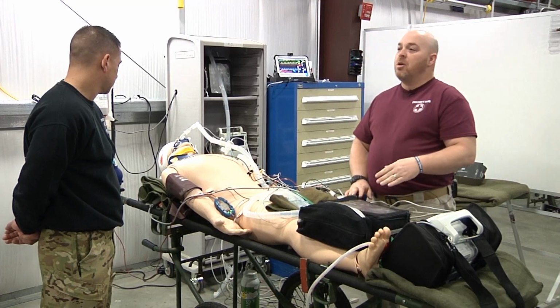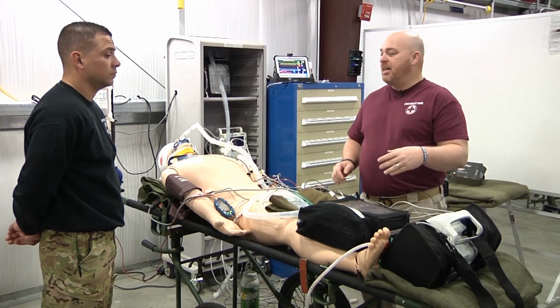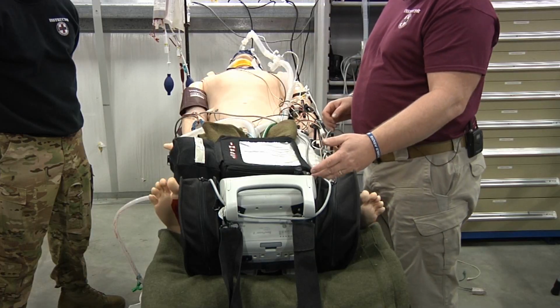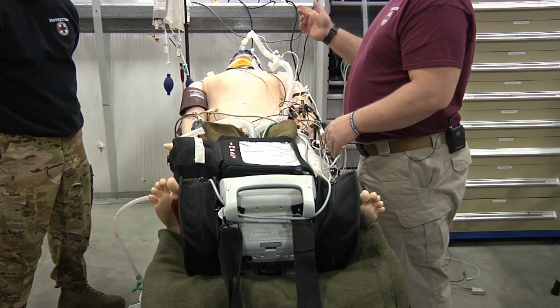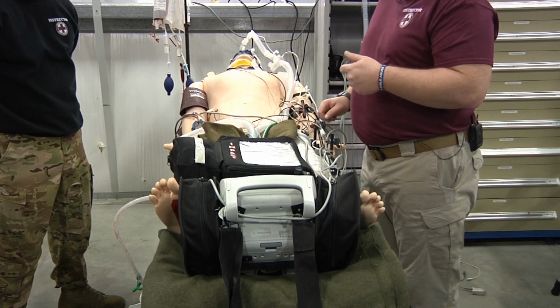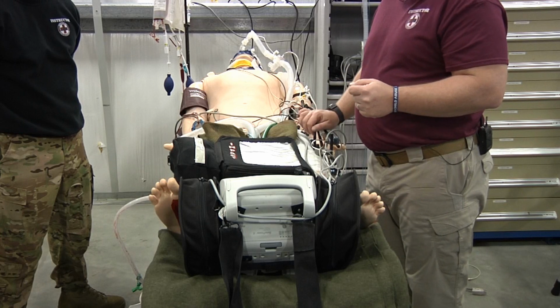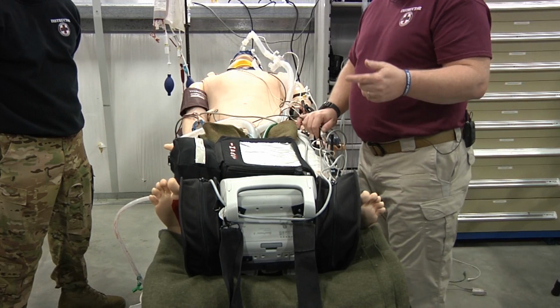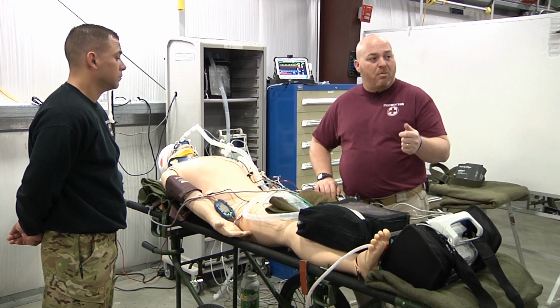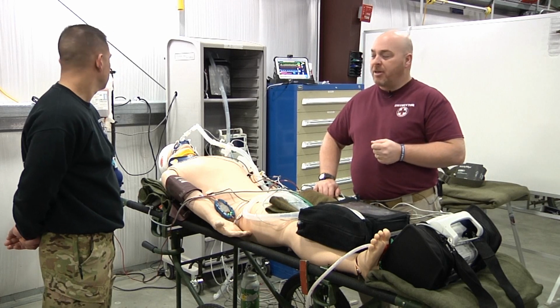All right. So we've assessed our distal pulses. We've checked CCT. We've ensured we have 2 points of access. We've flushed our lines. We've zeroed all of our lines. We need to make sure that all of our IV bags or blood bags are on pressure bags, they don't have to be at pressure for your flight. Fluids do run through gravity, and if they're on a pump, obviously they'll run off the pump. But it is good to have them on a pressure bag just in the event you need to give a little bit more fluid in flight. And it's also a little easier to hang them that way and keep them all together.